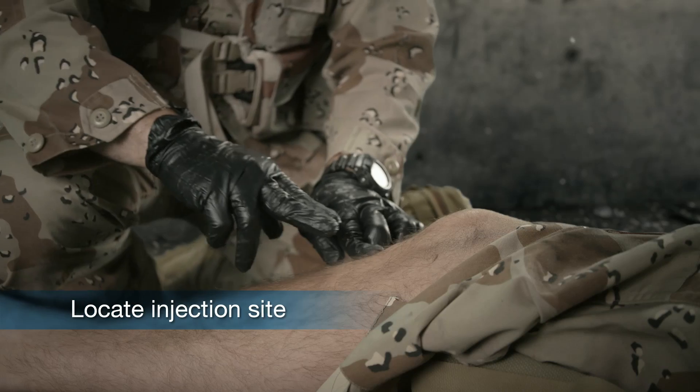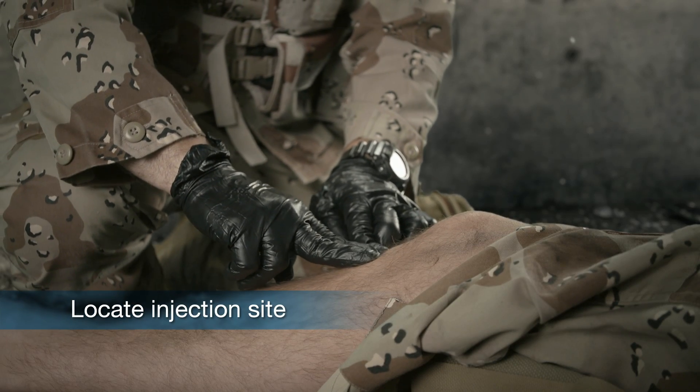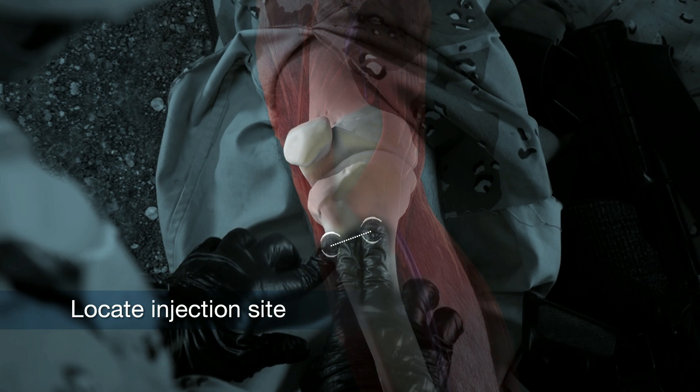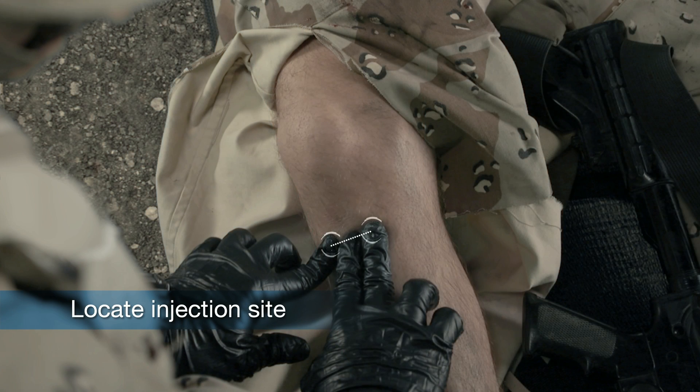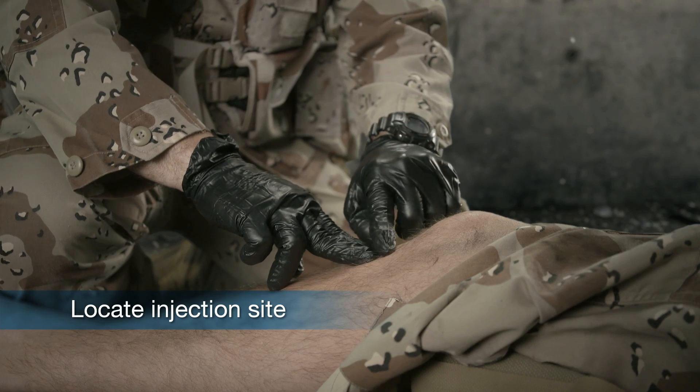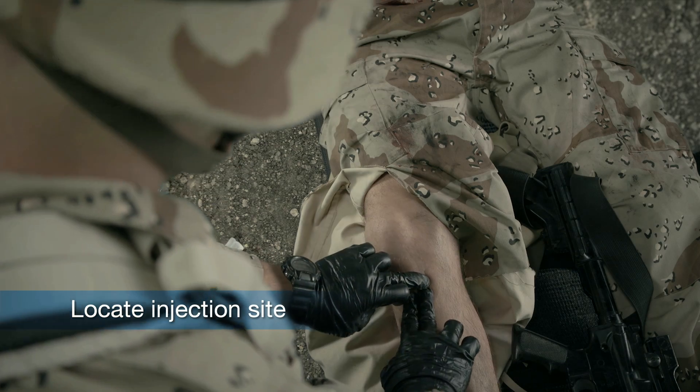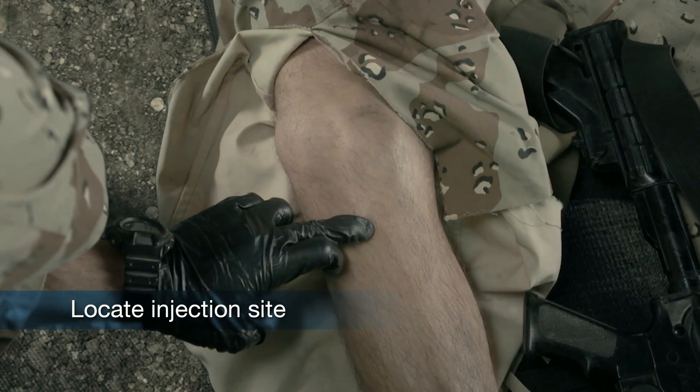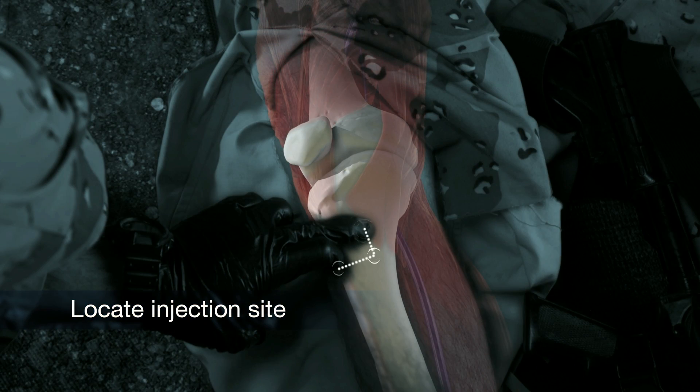This is the tibial tuberosity. Move approximately two fingers toward the inner part of the leg to find the medial flat portion of the bone. Now move up approximately one finger toward the kneecap. This is the correct location.